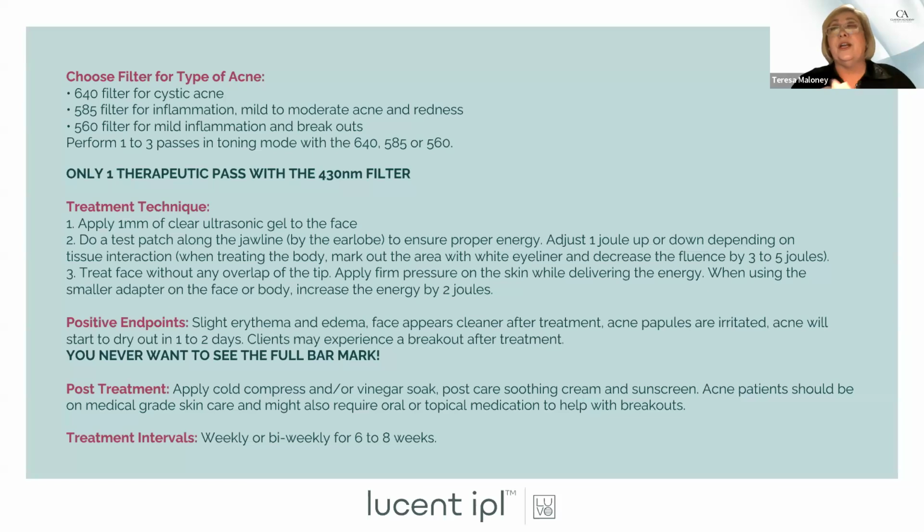But remember, first thing you're going to do is cause disruption. You're putting energy in so they could purge, they could feel dry, all of those things. You're going to switch their product, because if they're using stuff that you don't feel is designed for their acne condition, that's one thing you're going to want to switch out. By switching their products, their skin's pH changes, they could have a problem with that too and cause more of a breakout. So you need to really be confident with them: please give me 3 months to make these changes for you, and expect that there's going to be some breakout, but these are good things. This is how we're going to start resolving the issue.